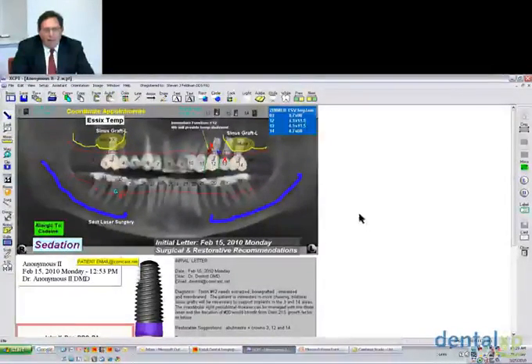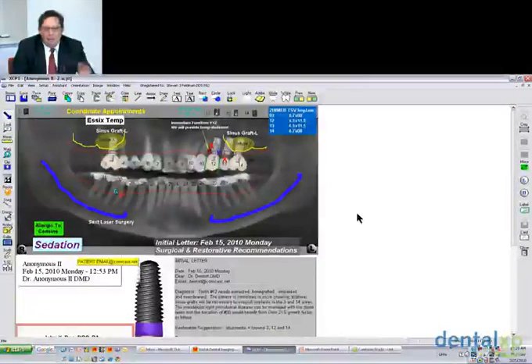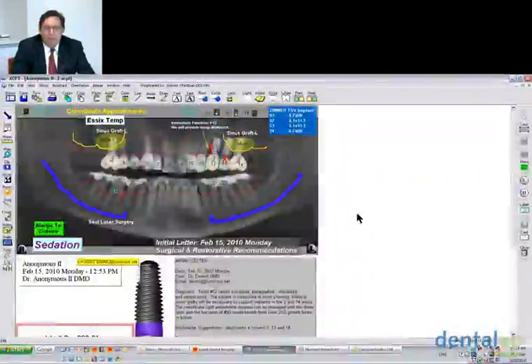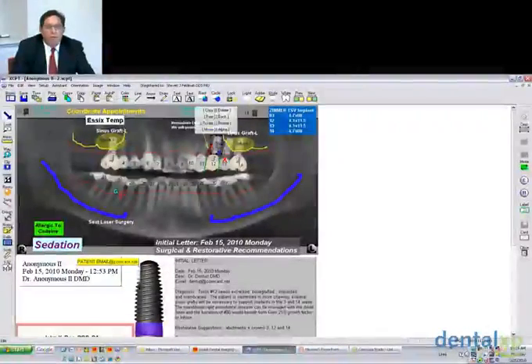This is our asymptomatic subclinical test. In cardiology, it's the cholesterol test and everything else. In dentistry, it's CT, it's 3D. And in order for 3D, in my opinion, to be effective, and we find it to be most effective, we use Accept here because it documents all the 3D. And then after it documents, as you can see, we can place implants in and actually show the patient the evolution of care or the end in mind.